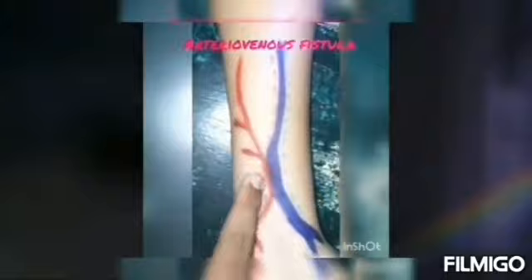This procedure takes a few hours and is generally an outpatient procedure which can be done under general anesthesia or through numbing of the arm. So how is it used in dialysis, or how is the patient connected to a dialysis machine? A nurse starts the dialysis treatment for the patient by inserting two needles in the AV fistula. One needle, which is connected to the artery, removes the blood and sends it to the machine, where the filtering of blood is done. The second needle, which is connected to the vein, returns the filtered blood back.